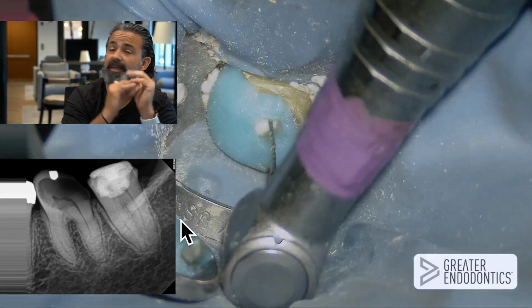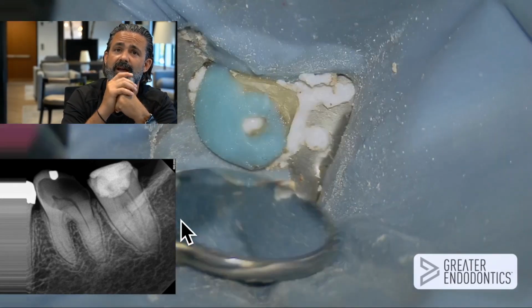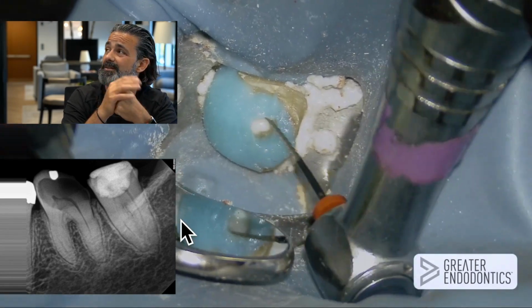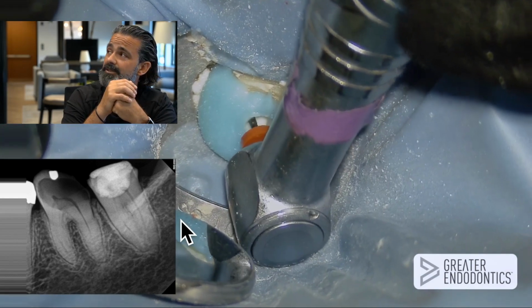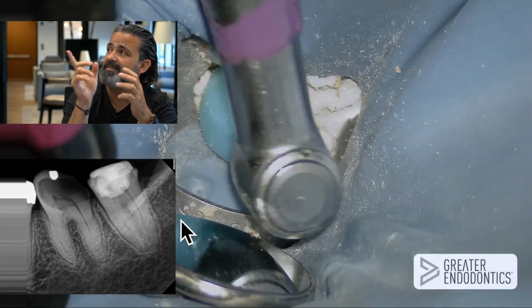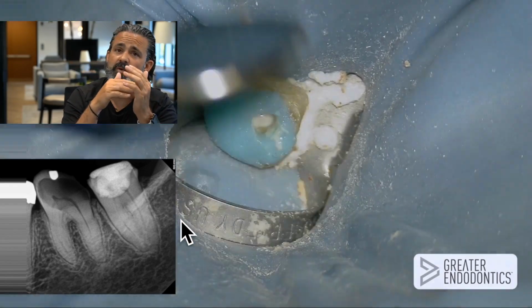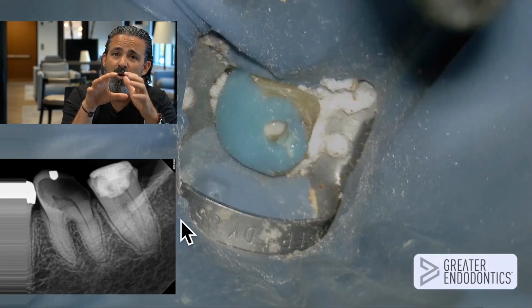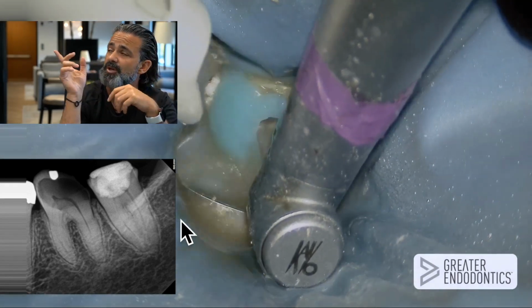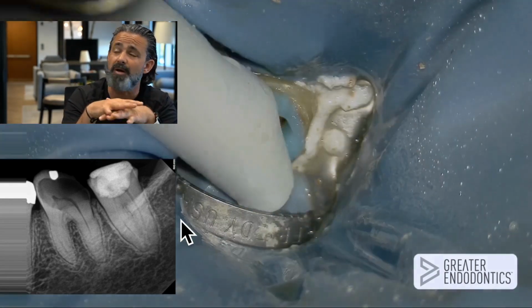And that's my timeout, because I've learned now of doing all these GentleWave cases that I'm going to actually employ the GentleWave to help me establish my length. Might be kind of crazy, but I don't want to break a file. And what I've decided to do is go one size bigger to see if I can push a little bit harder, if it's a stone or some sort of calcification I can push through. So I did pass one more file, and that was a 2504. Had no problem in the distal.